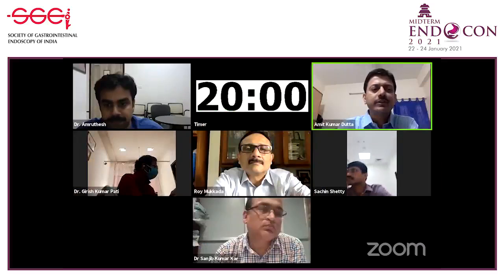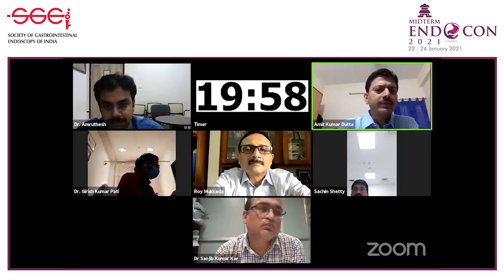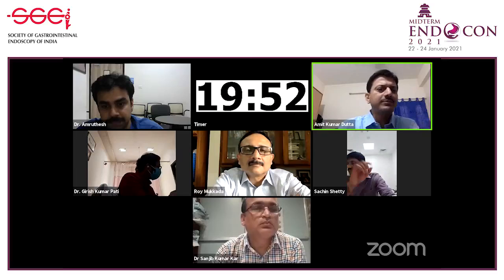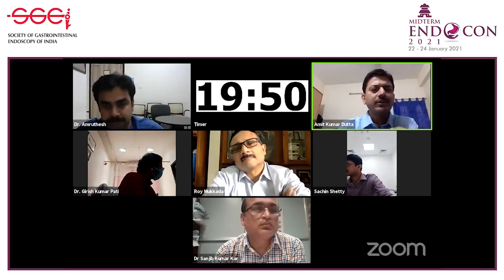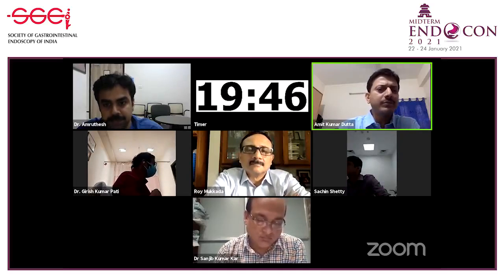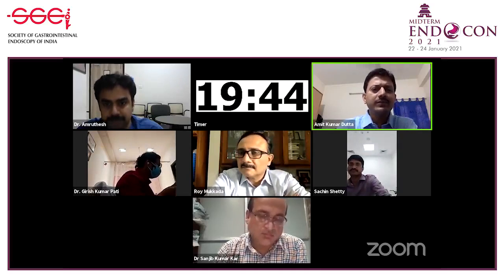because that's why it's used very frequently. But outside of Japan, what is popular is the NICE and the JNET. The thing with JNET is because in NICE type 2, they have clubbed together different types in one bucket, and some lesions may not be good for EMR, they may need ESD. That's why JNET is probably the practically good classification.